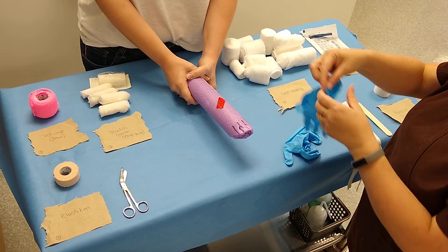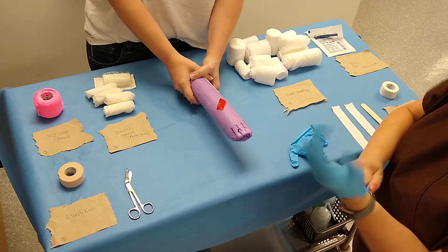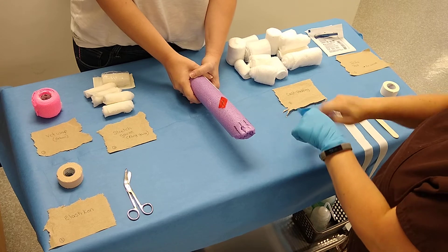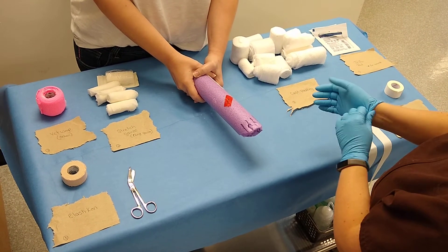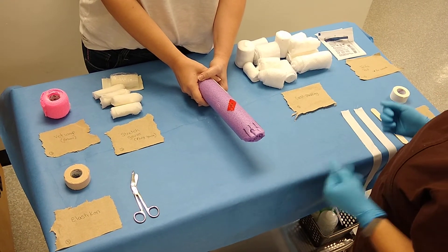We're going to demonstrate how to do a modified Robert Jones bandage. It's going to be put together the same way as a regular Robert Jones bandage, except we're going to replace the roll cotton with cast padding.